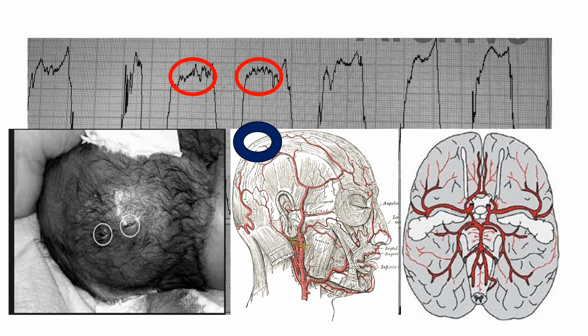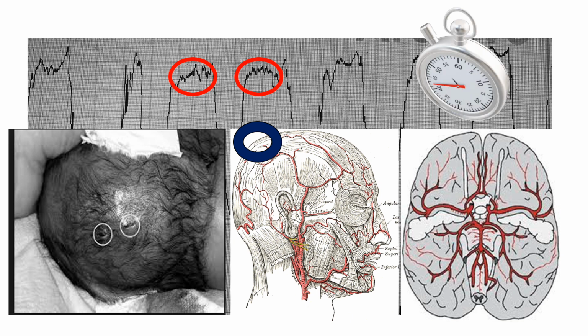And always look in between the decelerations and ask yourself, is the baseline variability normal? Then there is no acidosis. And also, please don't forget that fetal blood sampling takes a median time of 18 minutes according to published data in the UK. So in a fetus with subacute hypoxia with catecholamine response, if we attempt a fetal blood sampling, not only does it not improve neonatal outcomes, not only does it double the cesarean section rate, it may also delay delivery, leading to poor outcomes.